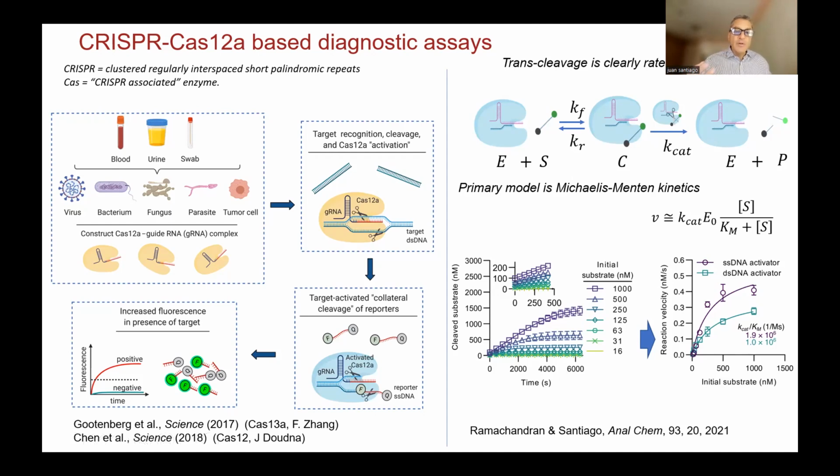The concentration of these probes, or say reporter molecules, is significantly higher typically than the target. And so it's stoichiometrically favored to start cleaving these fluorophore quencher pairs, releasing this fluorescent signal, which is what's being shown here.